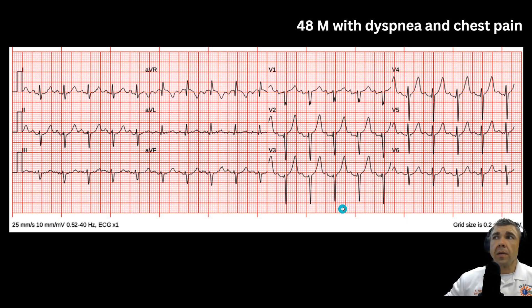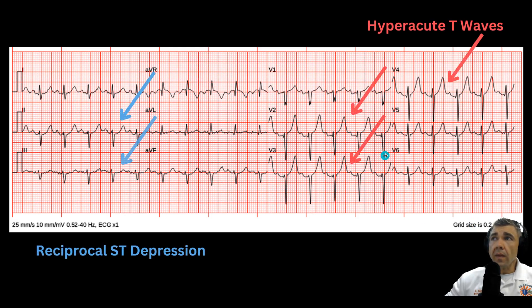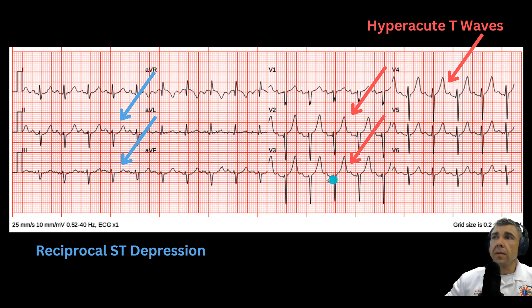It would be fine not to call this STEMI alert. However, this is an early anterior wall MI, and it's because of these T-waves — these are hyperacute T-waves. Early in an MI, when you're having ischemic tissue, you'll get these tall, symmetrical T-waves that you see in V2, V3, V4, even a little bit in V5. Symmetrical just means that they're mirrored left and right — almost a perfect isosceles triangle if you were to draw a line across the bottom.